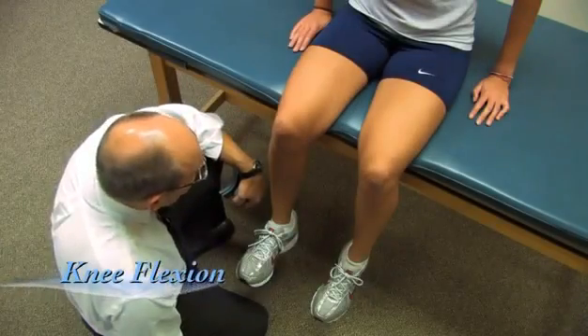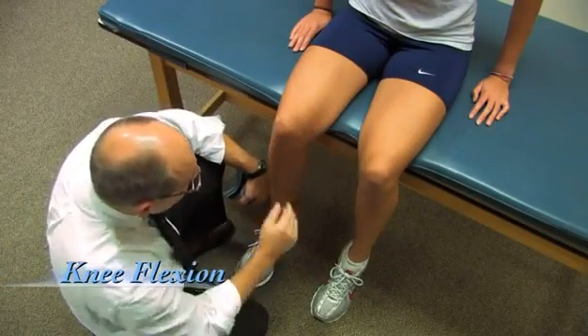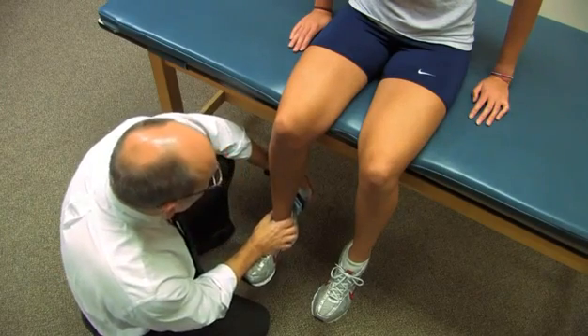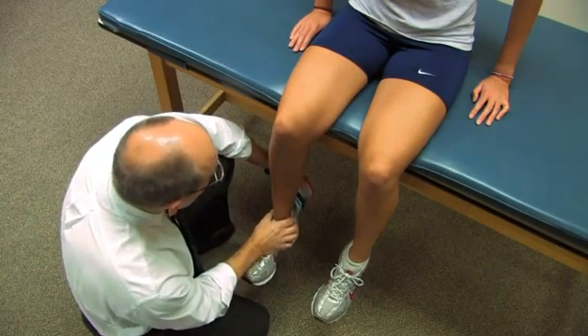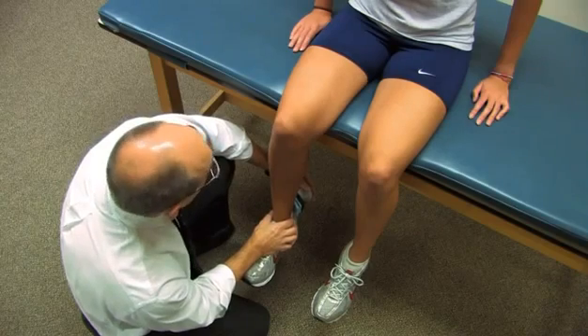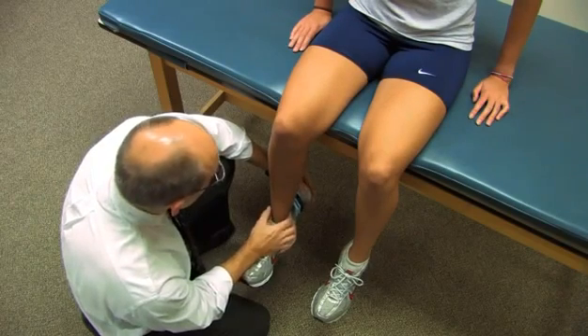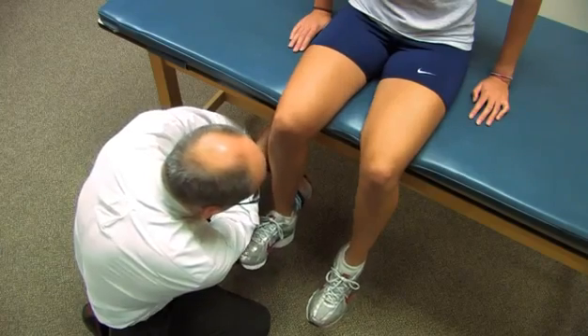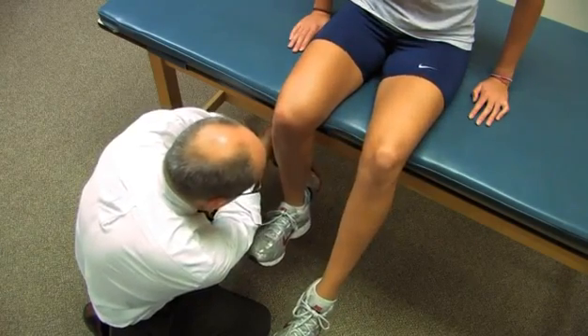Now we're going to measure knee flexion. Same position with the body. The dynamometer again will be placed just proximal to the malleoli, but in this case she's going to bend her knee backwards. I'm going to ask her to take a second or two, come to that effort, and continue until I say stop. Go ahead — pull it back, harder, harder. And relax.